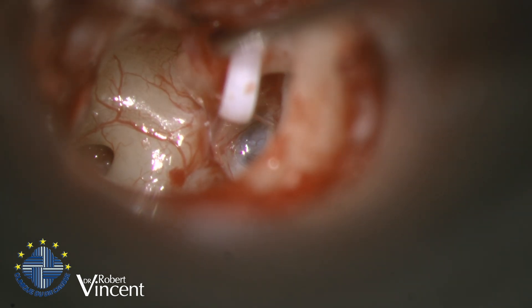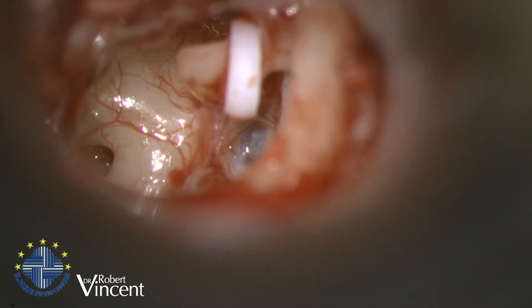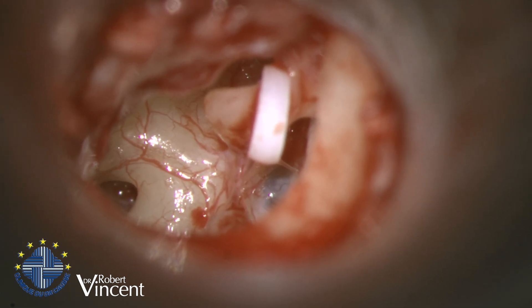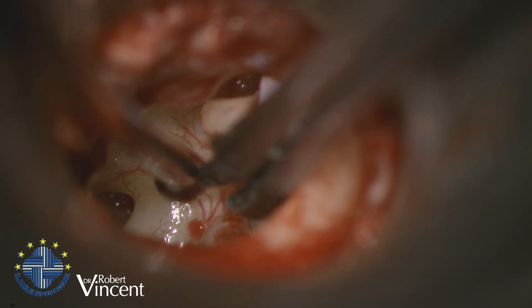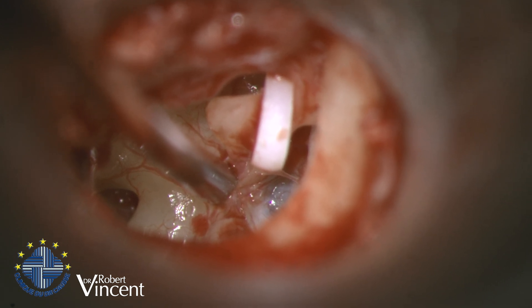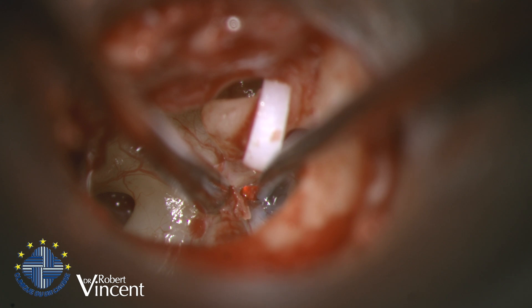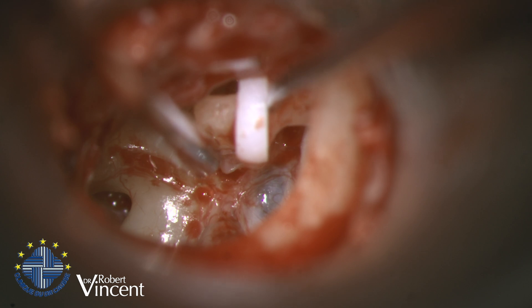What we need to do is change the prosthesis — this could be the cause of the problem. The malleus and incus appear fine, though with some strange mobility we'll check later, and there is an adhesive band here. First, I need to remove the prosthesis. There's not much difficulty removing it because it's a Teflon prosthesis, which is different from titanium — with titanium it could be dangerous. I like to check the distal tip, but not with a Teflon prosthesis. The main concern is that it's very anterior, so we need to be cautious about the saccule and utricle. I will remove it now.